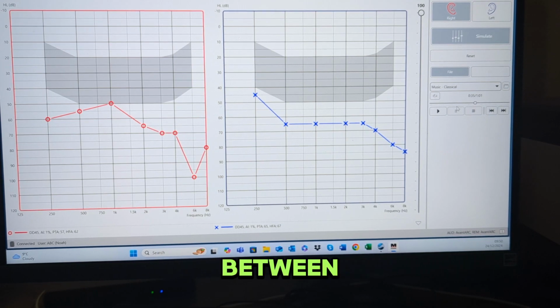Yeah, so the difference between the right and left is very difficult for you to assess through the speakers, I'm sure. But what I'm listening to is a slight tonality difference between the right and left. And that would be purely because of the shape difference between the right side and the left side. So that was quite an interesting case.